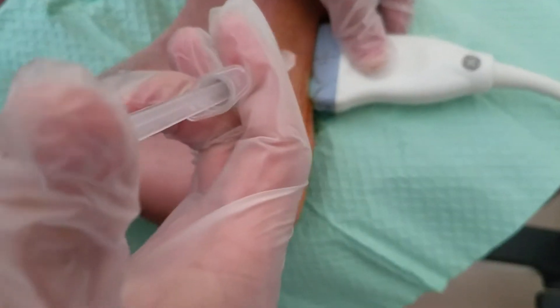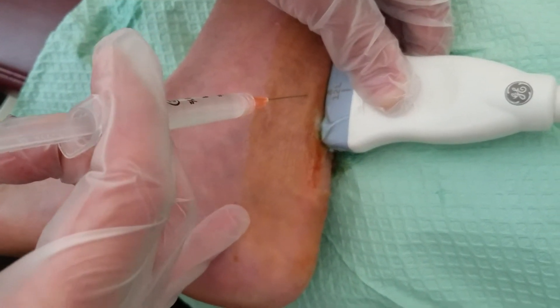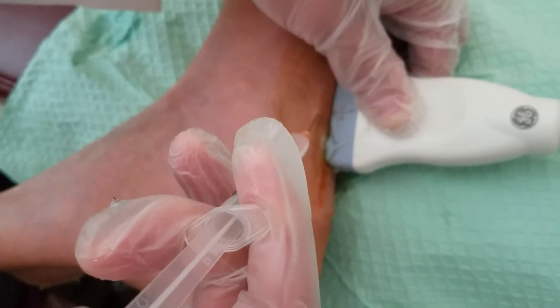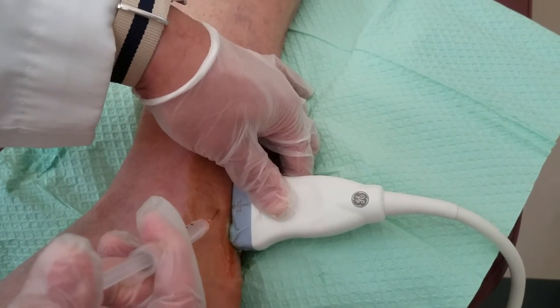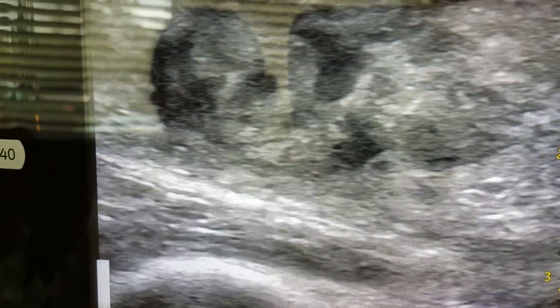I'm going to prep with betadine. We're going to go right about here, right in the middle. I can see my needle filling in the gap — you can see the fluid moving into the Achilles tendon right now.